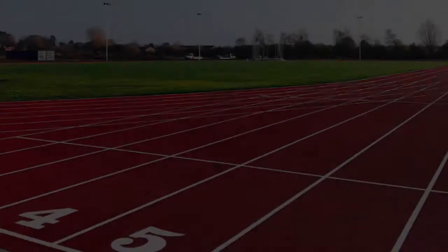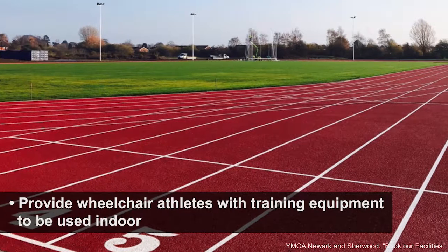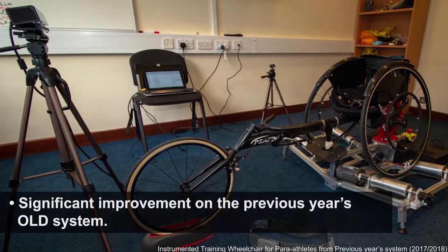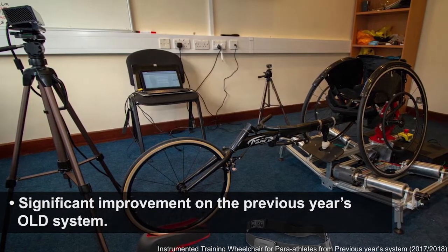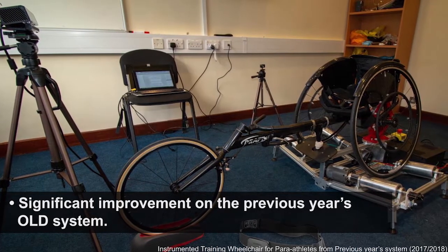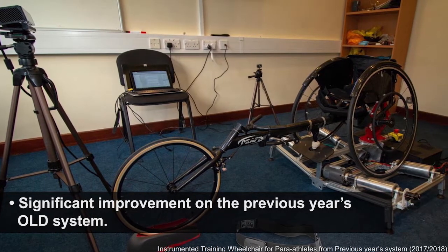The aim is to provide wheelchair athletes with training equipment to be used indoors at their own convenience. This project builds and improves on a previous year's system, which provides different metrics for the coach and athlete during training. This helps the athlete to improve on their racing performance.